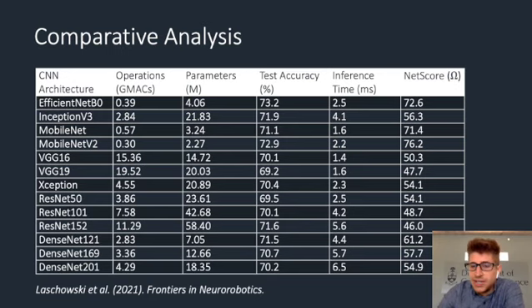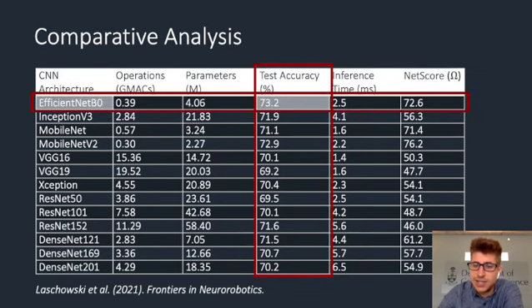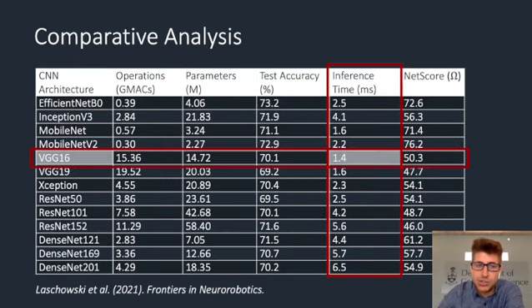So the ExoNet dataset also allowed us to perform one of the first large-scale comparative analyses between different deep learning models on a computer vision dataset specifically for robotic prosthetic legs and exoskeletons. And our analysis showed that the EfficientNet B0 network, which was developed by Google, was able to achieve one of the highest overall prediction accuracies. We also showed that VGG16 is able to achieve the fastest inference time, which can be important for real-time control.